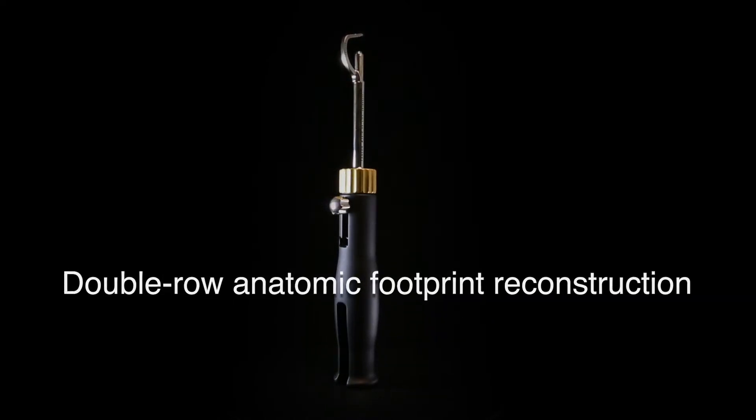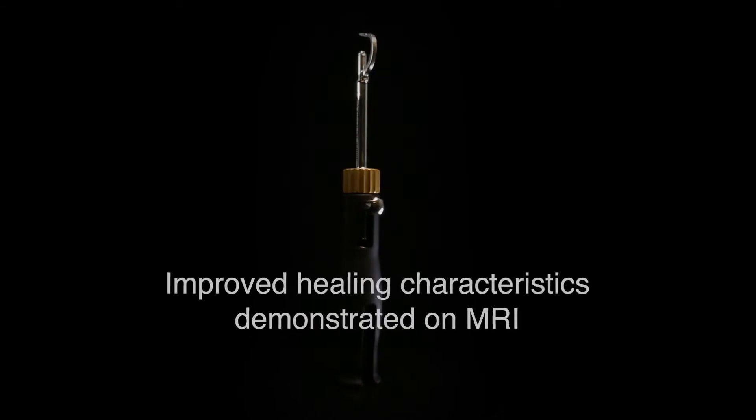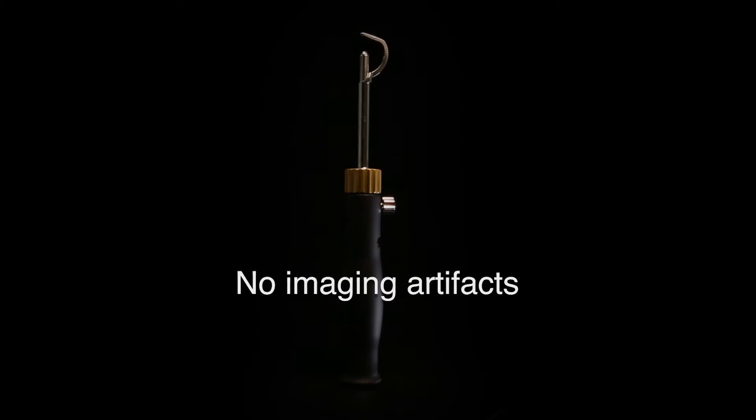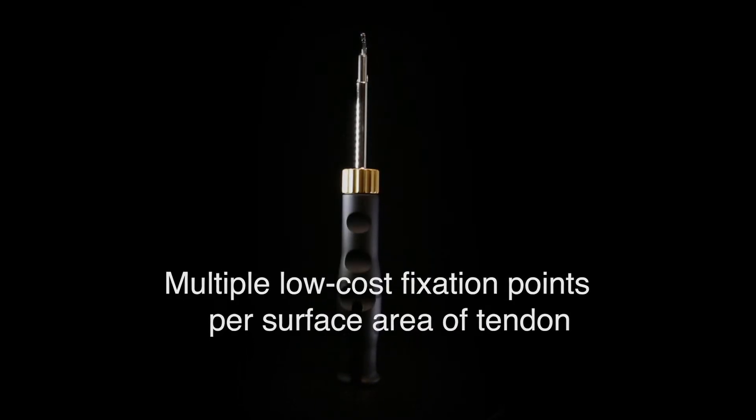double-row anatomic footprint reconstruction, high-strength suture, improved healing characteristics demonstrated on MRI, no imaging artifacts, and multiple low-cost fixation points per surface area of tendon.